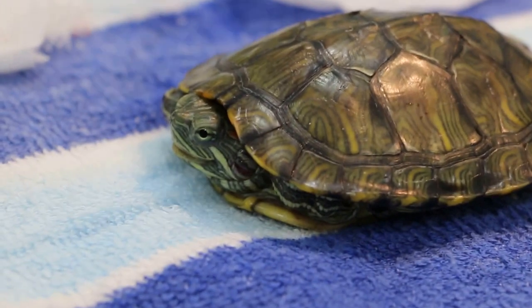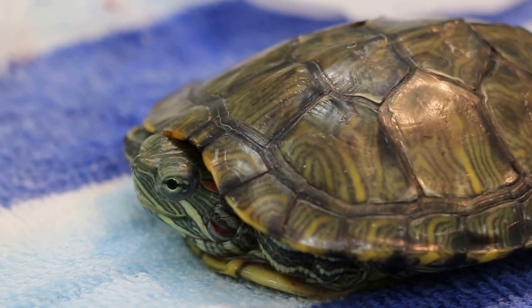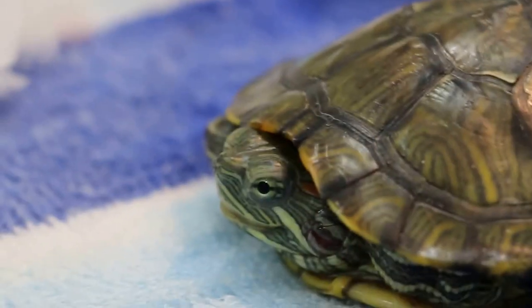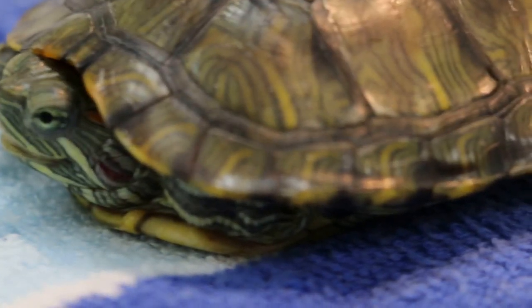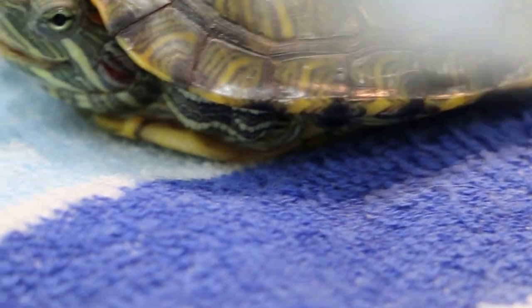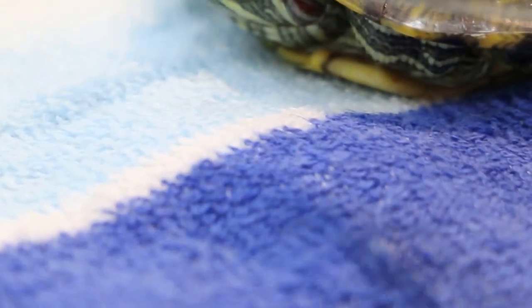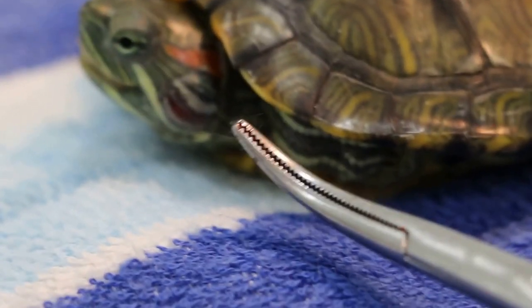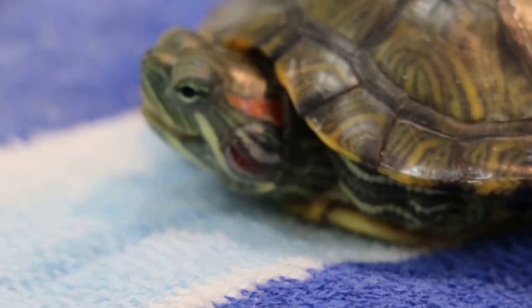Basically, the ear abscess is lanced with a scalpel. After anesthesia is given, then the terrapin is held and the scalpel will lance the ear abscess and the pus is curated out. Then the cotton bud will clear more of the pus.